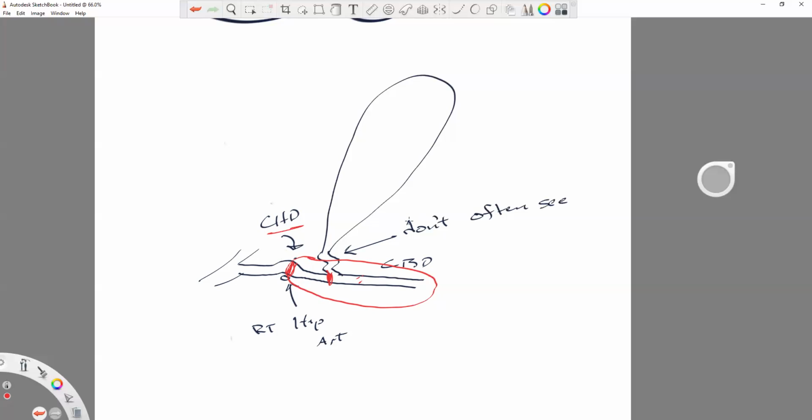Where does this happen, by the way, guys? That red circle, or how about this, right? All of this right in here, that is right at the hilum of the liver, not an inch inside the liver. If you're an inch inside the liver, you are clearly at that point in the right portal system.